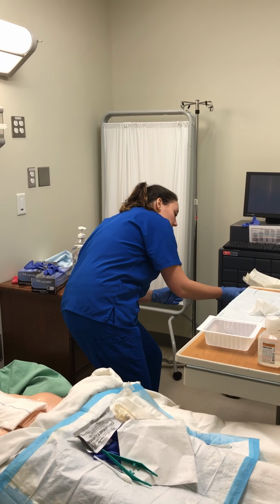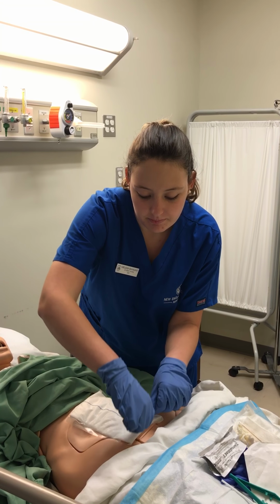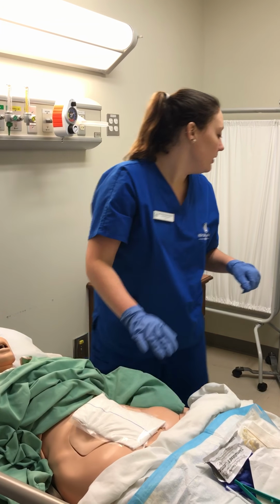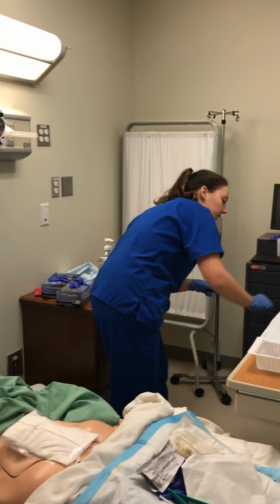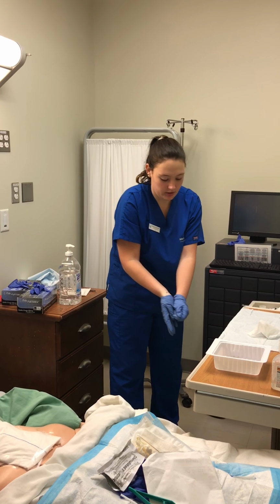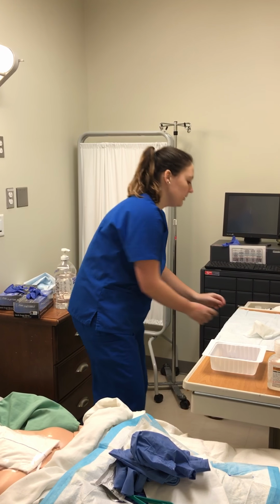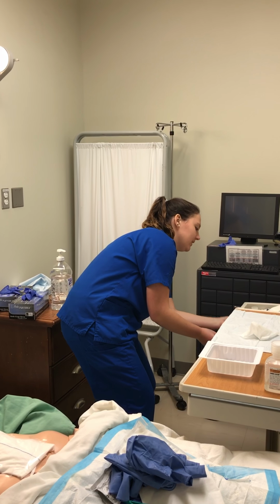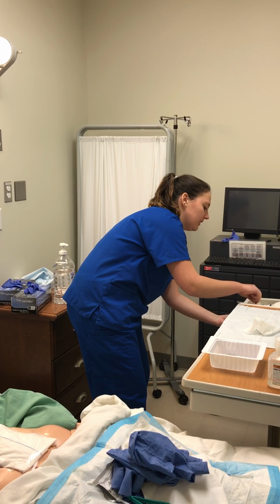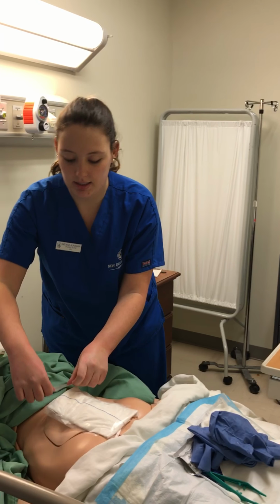Okay. And like I said, the sterile part is over, so just to show you, I'm going to take these gloves off, and I'm going to get the last piece of tape that is stuck, and I'm going to come over and put it on the last side.